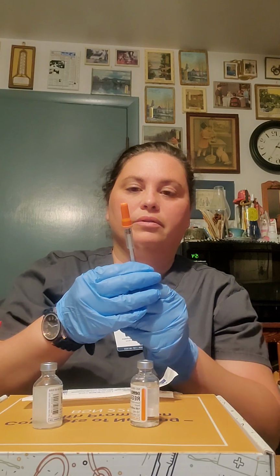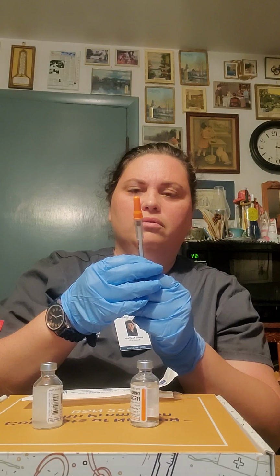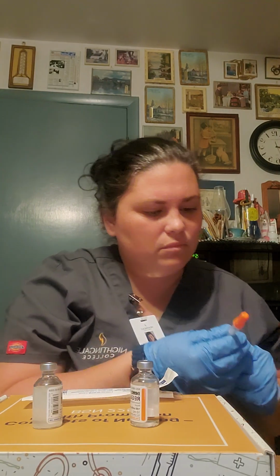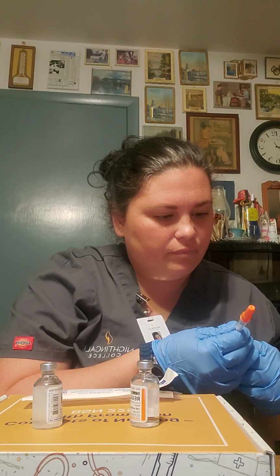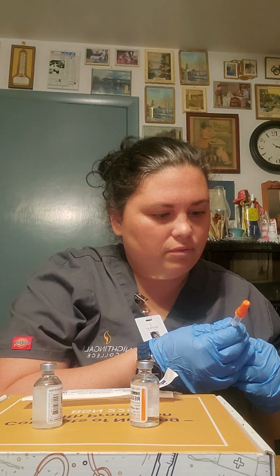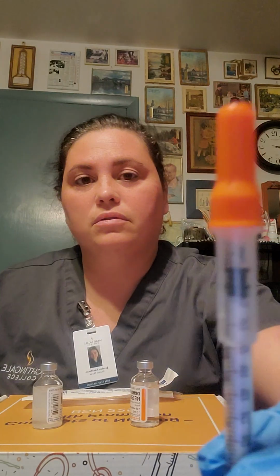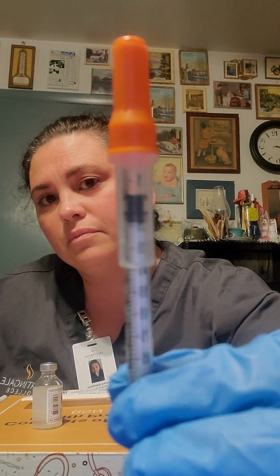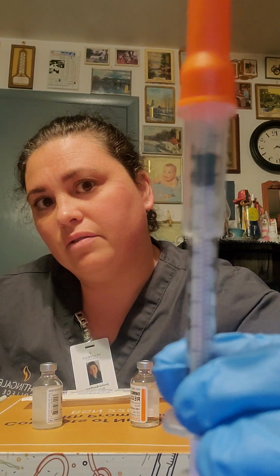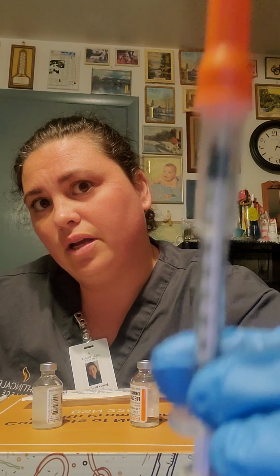Okay, so I'm going to draw 8 units. Alright. I don't know if you can see that. I'm trying to get it to focus. I got 8 units there.